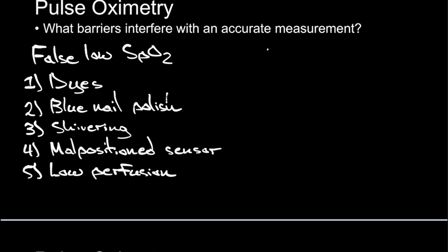A few things that I'd like to mention. Bilirubin has no effect on the SpO2 reading, neither does hemoglobin F or sickle cell. Acrylic nails, those don't affect it. Fluorescent dyes have no effect. And then, importantly, if you ever have seen cyanosis in patients, you probably won't forget that. And that occurs around SpO2 less than or equal to 85%.